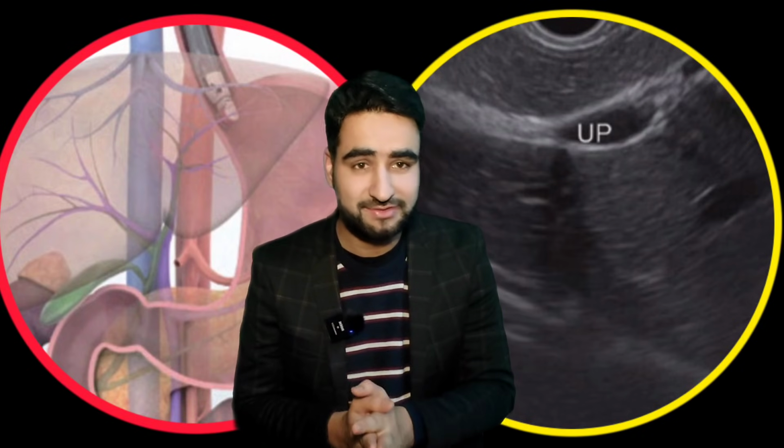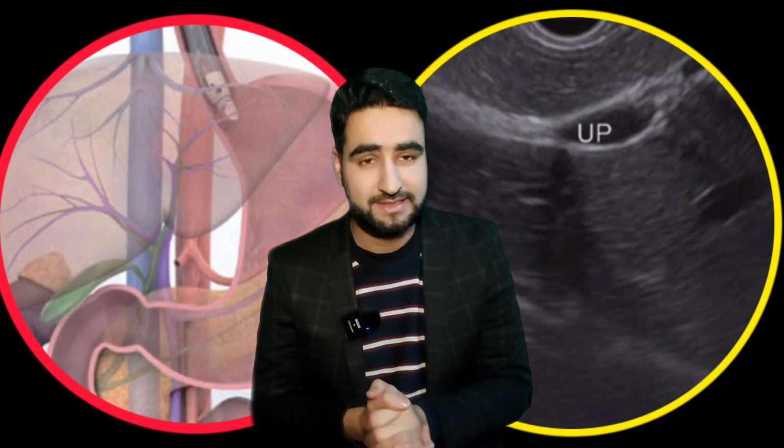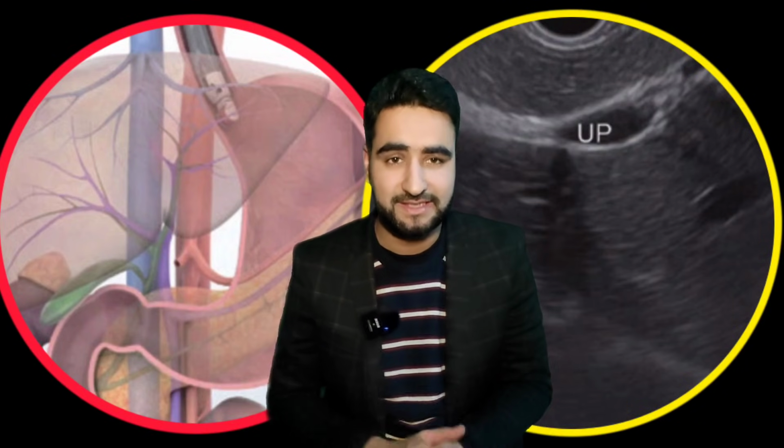Remember what I taught you earlier. Inferior structures always start appearing from the left. Keep pushing down and you will notice something important. The left portal vein enters your screen from the left. Why? Because the portal vein sits at an inferior level compared to the hepatic veins.